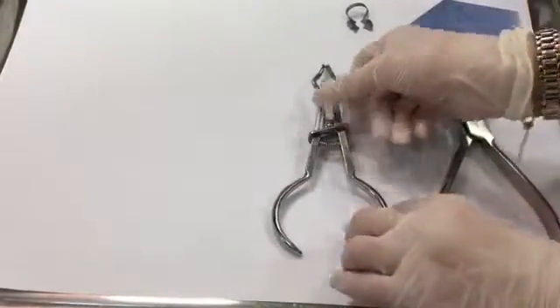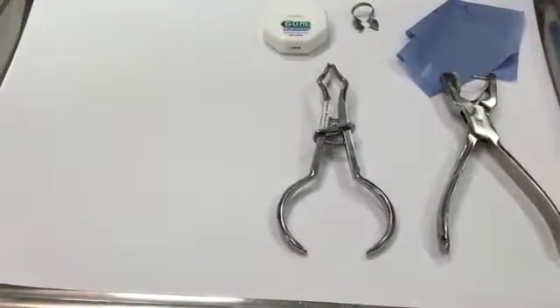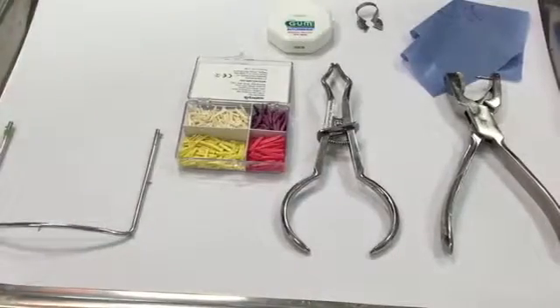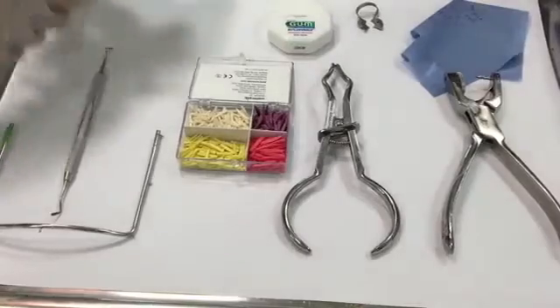The equipment we're going to need for the rubber dam are a rubber dam puncher, a clamp, rubber dam forceps, dental floss, a wedge to stabilize the rubber dam frame, a plastic filling instrument, and finally, a napkin. For infection control, we're going to need a gown, a face mask, a face shield, and gloves.